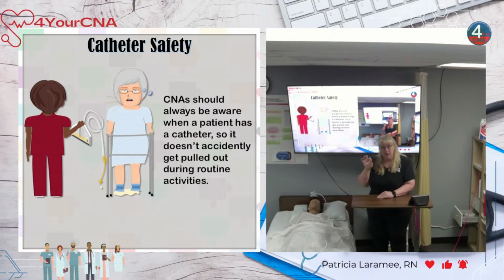Because sometimes when a catheter gets pulled out, that bubble gets burst, just from the pressure. And if the bubble burst, I have to make sure that no pieces of it got left behind in the patient. The only way for me to find that out is to look at the catheter itself. Does that make sense? If you tell me, hey, a catheter came out, I threw it away, I don't know where it's at now. Is there something left in the patient?